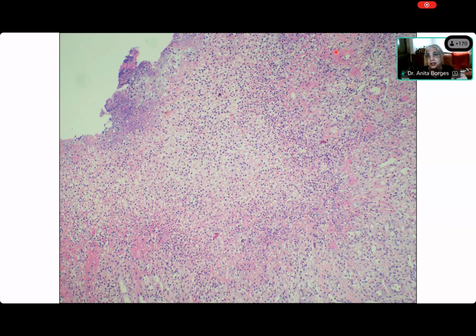What are these? You actually see this pink stuff that is surrounding the blood vessels, and that also is fibrin. Okay, and this fibrin is coming out of leaky blood vessels. Now, those leaky blood vessels are obviously capillaries, which are newly formed capillaries. And so it's leaking fibrin, and along with it you are seeing the polymorphonuclear cells. Okay, there are more mature capillaries that are being seen at the base of this particular section. See that so clearly.